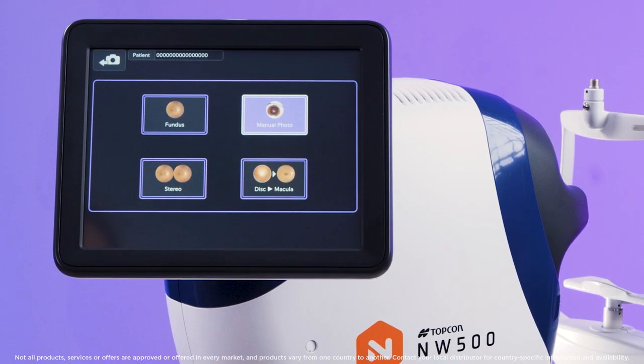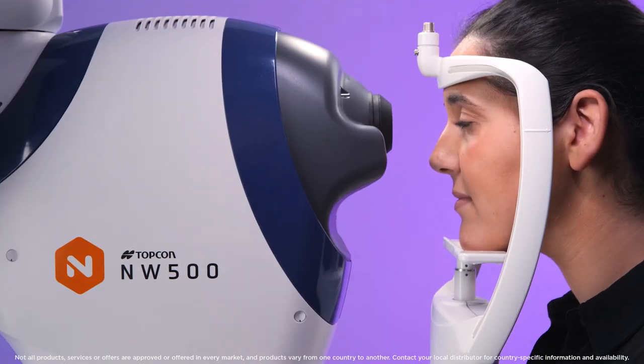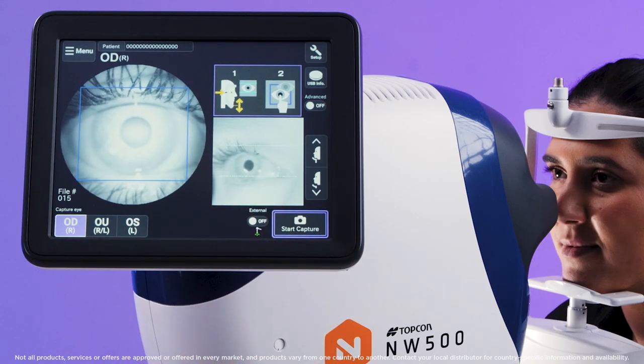Select manual photo from the main menu. Position the patient comfortably in front of the instrument. Ask the patient to place their chin on the chin rest and forehead on the headrest. The pupil should be positioned within the two blue lines.